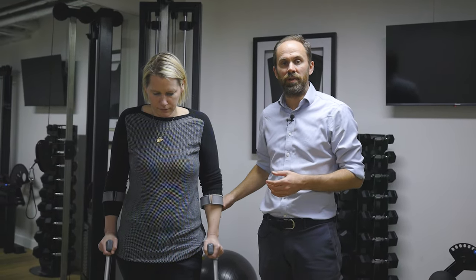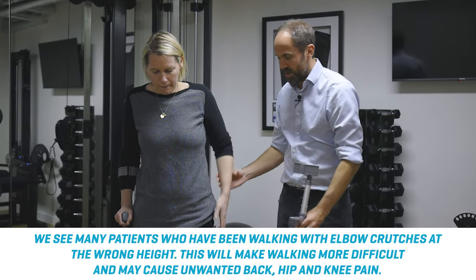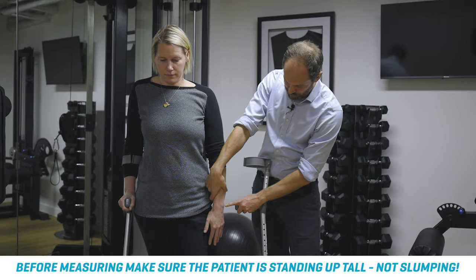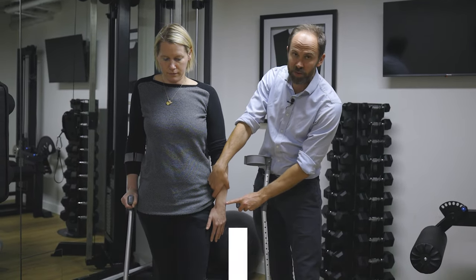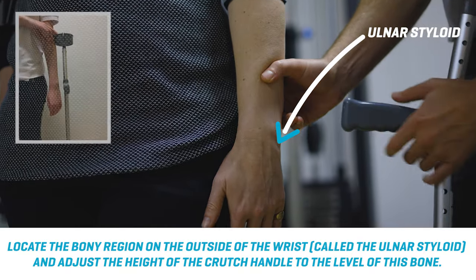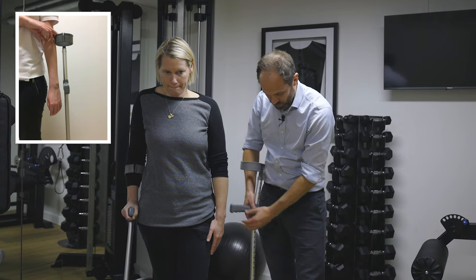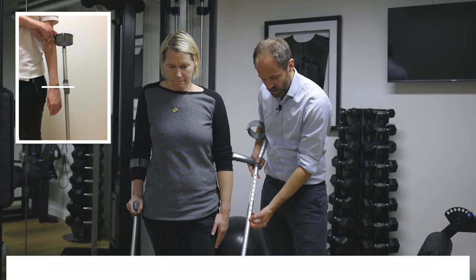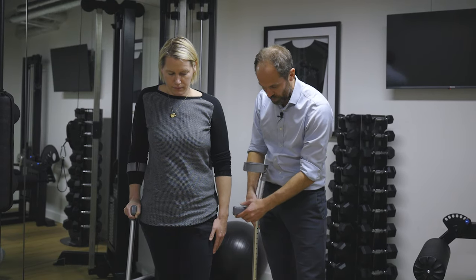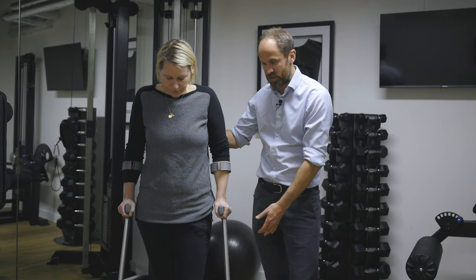The first thing to do is to make sure that you've got the elbow crutches at the right height. To do that, get your patient to stand up nice and tall, and you'll see this little bony bit on the outside of the wrist. This is called the ulnar styloid, and what you need to do is to line up the ulnar styloid with the level of the elbow crutch. You can adjust the elbow crutch using the pins here. Make sure that the handle is level with the ulnar styloid on both sides, and that should give you a nice position to start with.